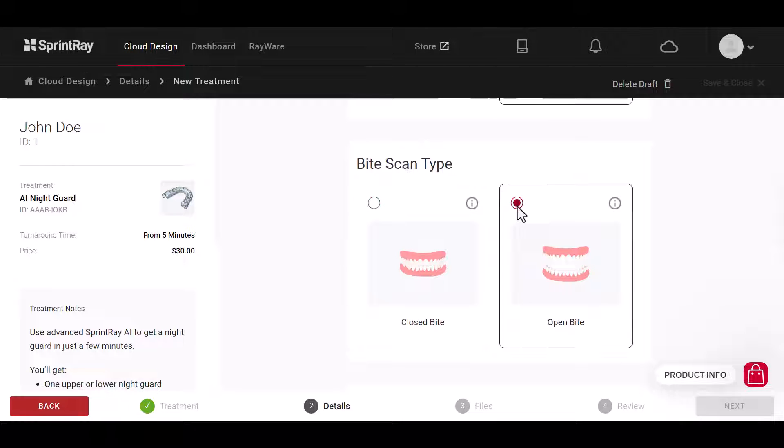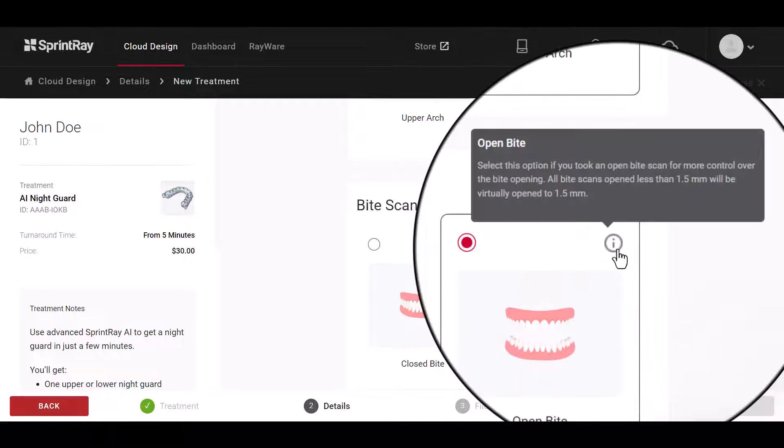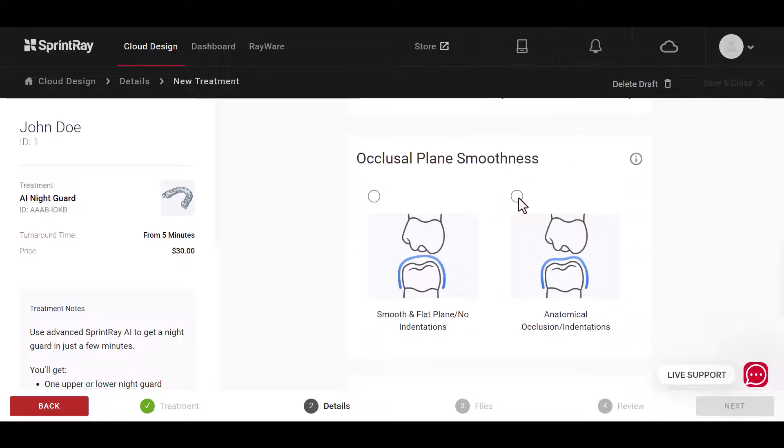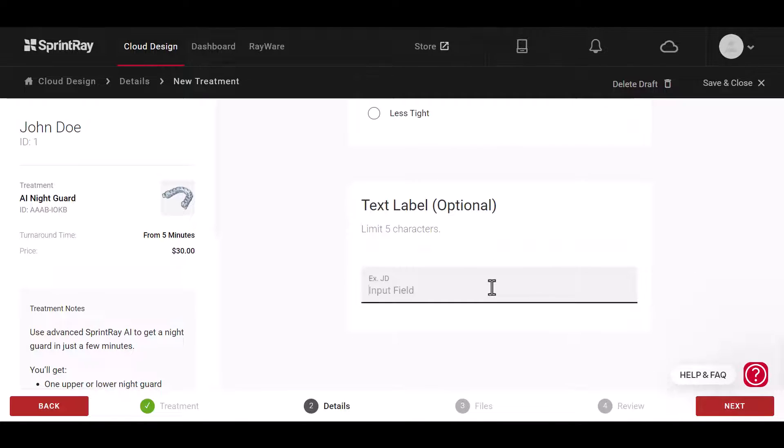For an open bite design, we suggest opening the bite at least 1.5 millimeters. If your scans are open less than that, we will virtually open the bite for you. Then select a few more preferences to round out your design.